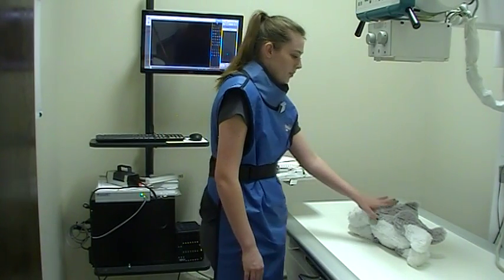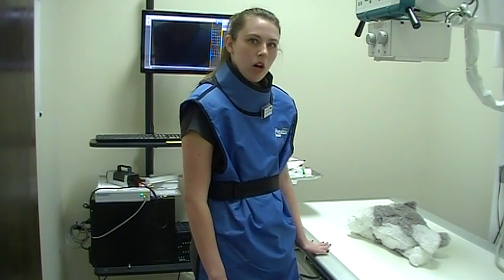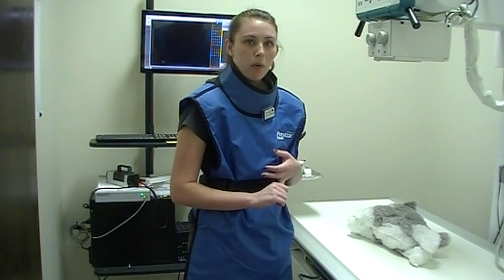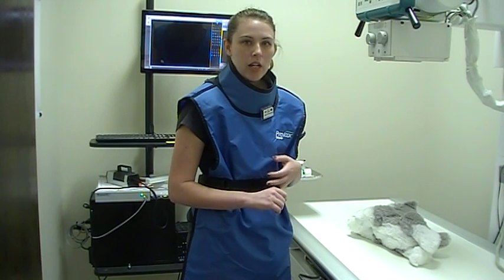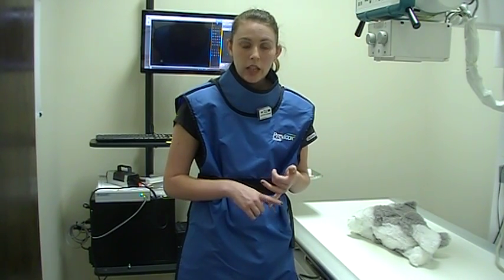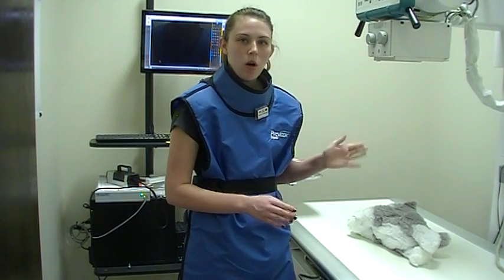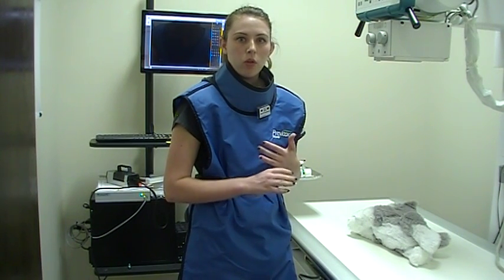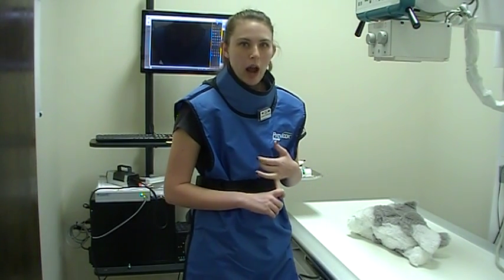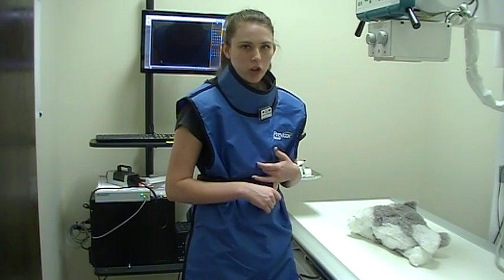So this is our patient, and he is going to be needing a barium contrast study today. We're going to get everything set up in our computer system — get the patient and client information so that our radiographs are properly labeled. I'm also going to set it up that we are taking a right side down lateral and a VD, which will be automatically labeled with the proper right label marker. Once we finish taking our radiographs and submit them, it will automatically add the hospital and doctor information as well.